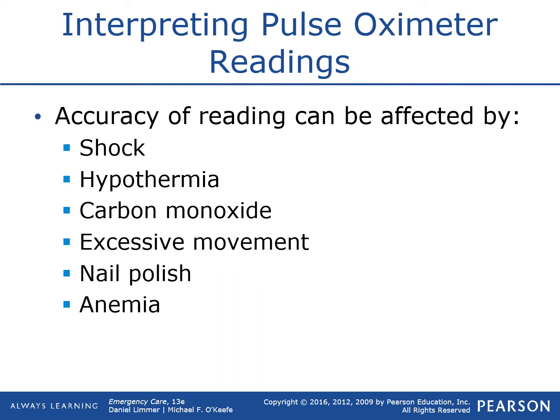So again, wonderful tool. It really is. It has done wonders to help us see how well patients are doing. But you also have to take into account the greater picture. So use that tool and take it into account with everything else that you're seeing. Don't just treat the tool. Treat your patient as a whole and use your tools to help you decide your treatment modalities.